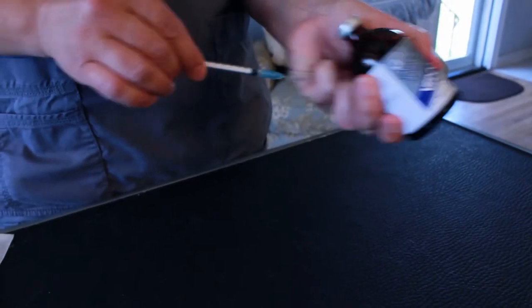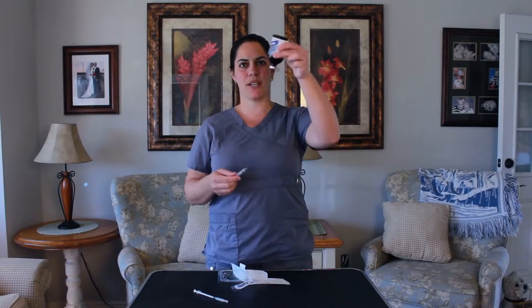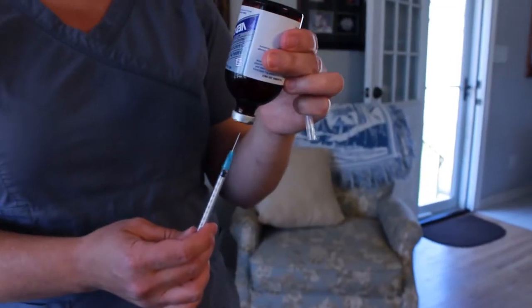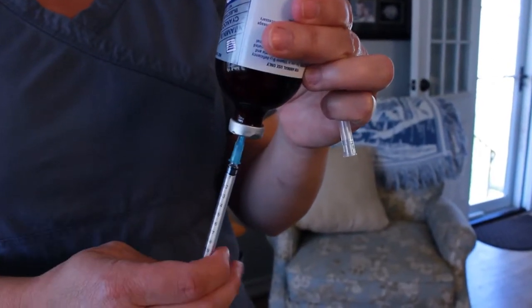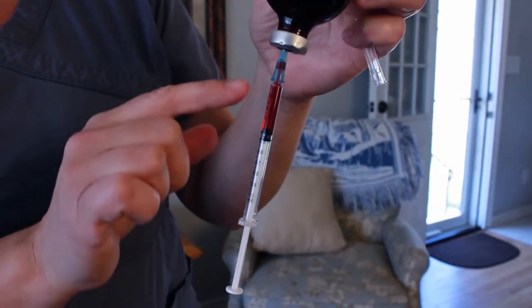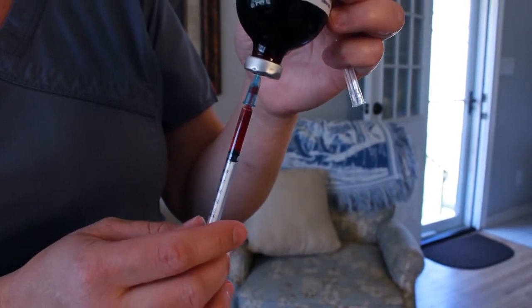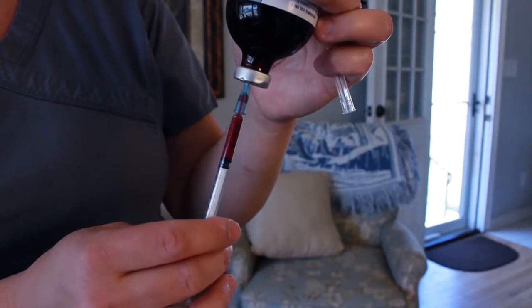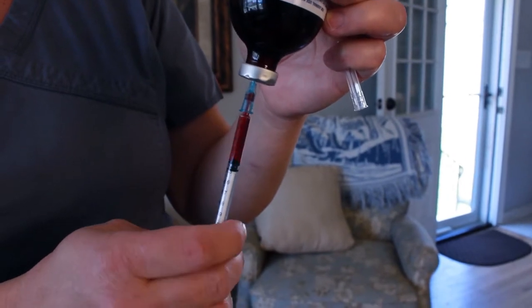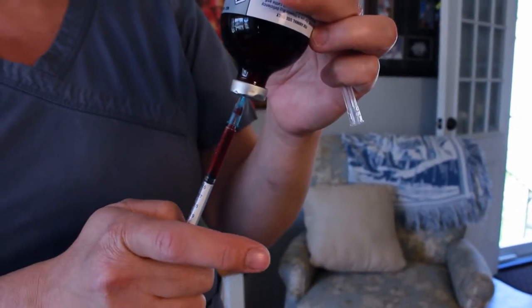The next biggest mistake people make is they try to put the injection in and they're like, I'm not getting anything out. To get something out, you have to turn the bottle upside down so the fluid gets pulled down from gravity. You're going to put the needle straight in and pull the medicine out. Sometimes you'll have an air bubble in there — it doesn't really matter for sub-Q or IM injections. Air bubbles are really only important for IV injections, so don't worry about air bubbles. You can avoid an air bubble by pulling up more than you need and then squirting it back into the bottle.